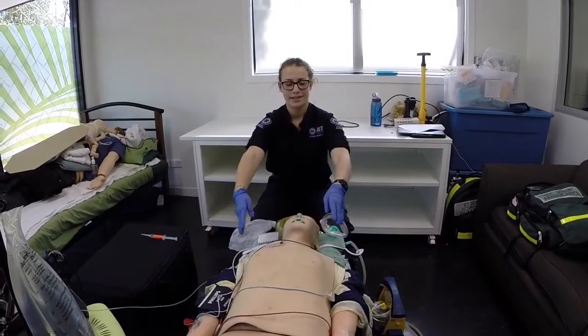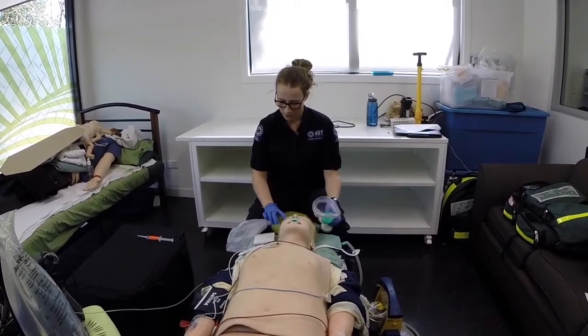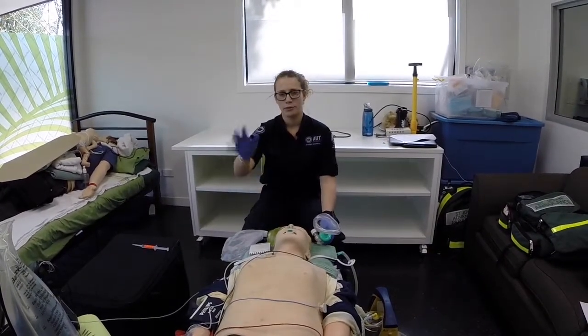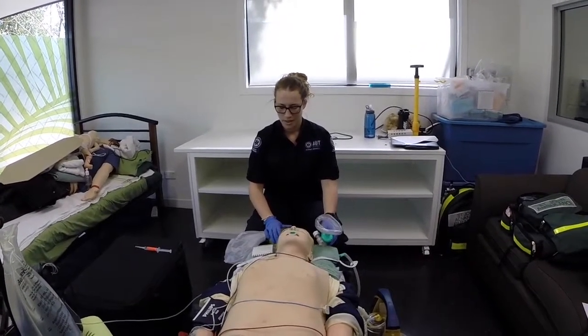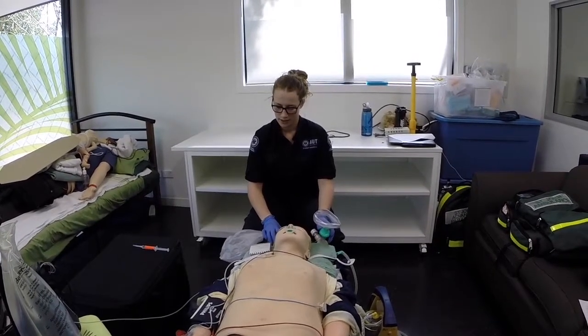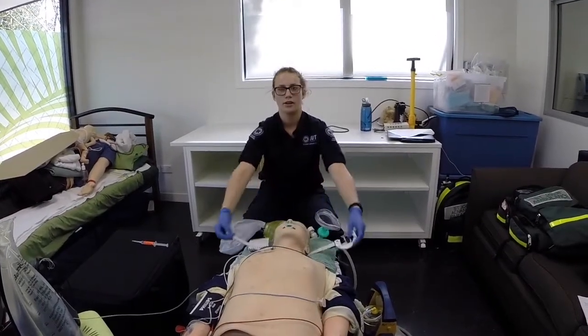Gain IV access in 2 sites, preferably. So we've got 2 16 gauges in the ACFs of both arms for this patient. Prepare a running line of 0.9 sodium chloride. So we have it prepared but not currently running. Place a folded towel under the head. Yep, we've got the patient in the sniffing position at this moment. Place an ETT holder with a strap under the head. So we've got this strap here and ready.